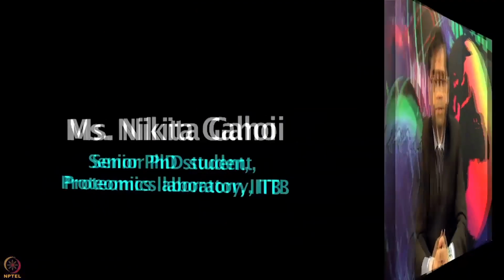These things are going to be discussed in much more detail. Nikita is going to demonstrate the entire experiment in the context of autoantibody signatures of brain tumors. So, let us have this lecture and try to understand the workflow involved using purified protein from HuProt chips and its applications in brain tumor research.